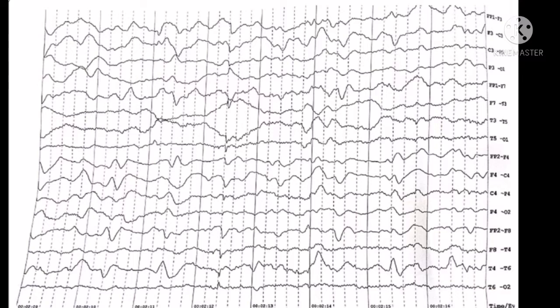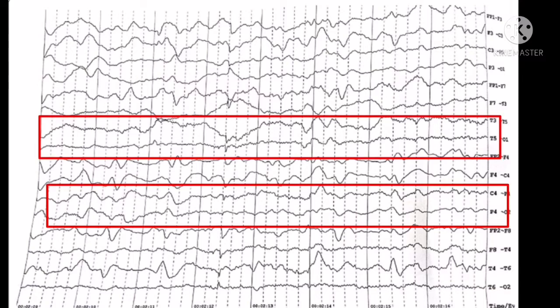For example, if there is generalized slowness, this may be due to encephalopathic process or due to drug effect or post-ictal state. Usually if it is encephalopathic process, this is the slowness of the posterior dominant rhythm with disorganization of the rhythm with excessive theta activity anteriorly.